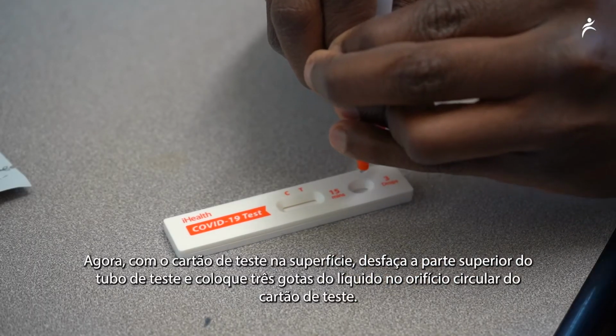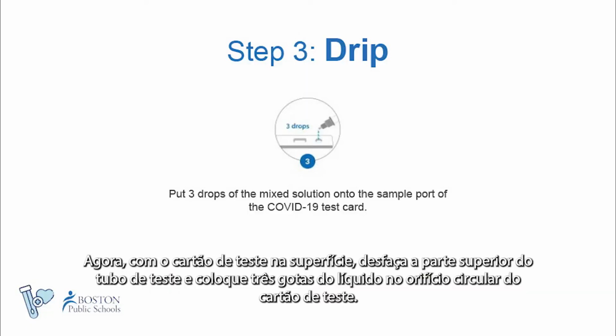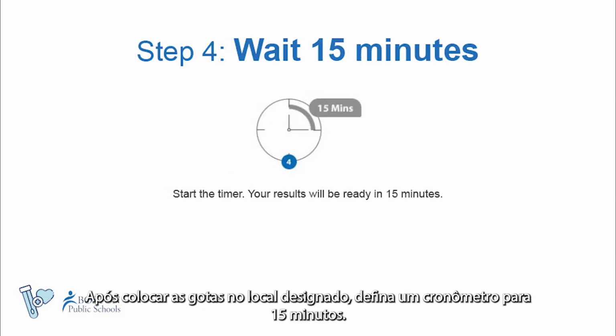Now, with your test card laid flat on the surface, undo the top of the test tube and put 3 drops of fluid into the circular hole on the test card. Make sure to squeeze the tube hard in order to get the droplets onto the card. Once the drops are in, set a timer for 15 minutes.